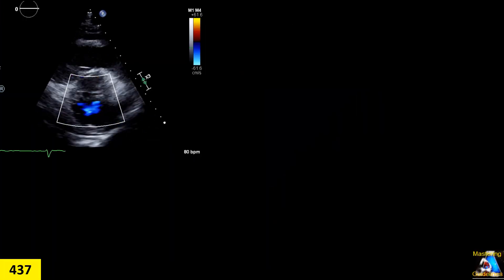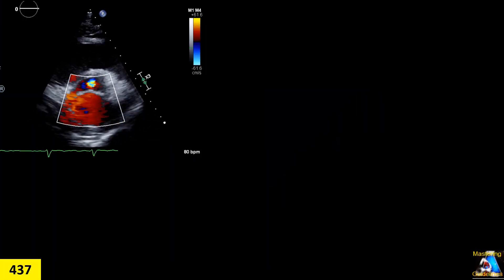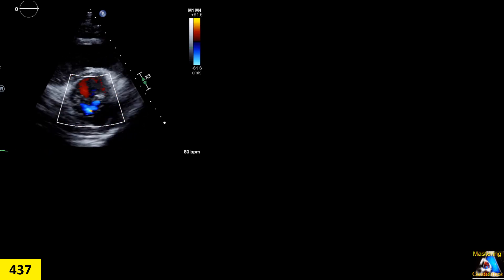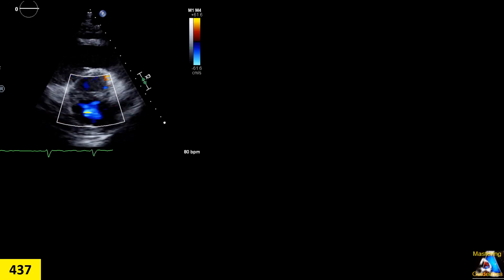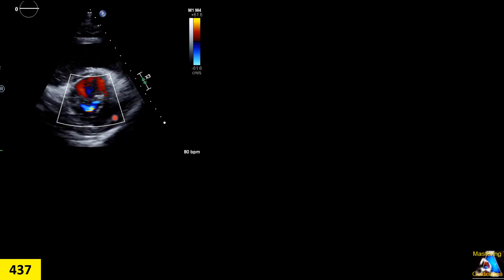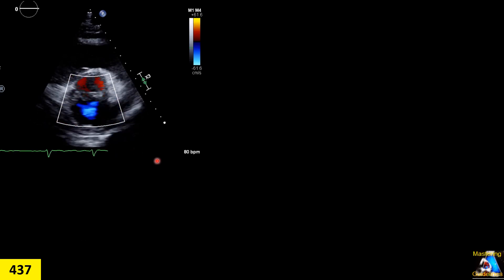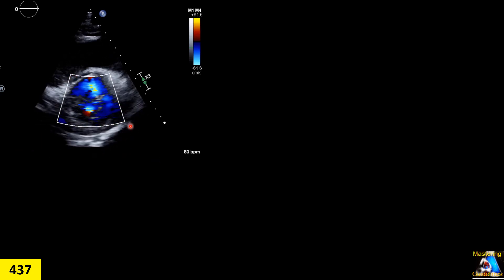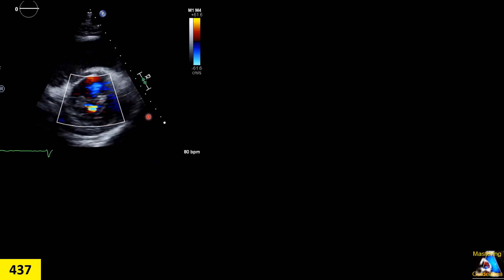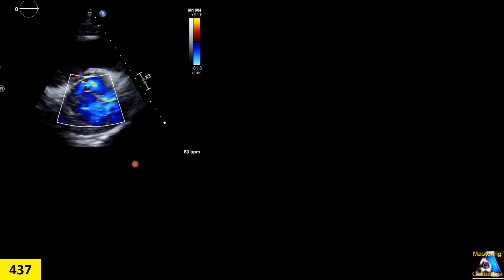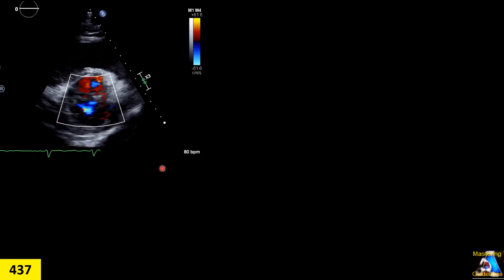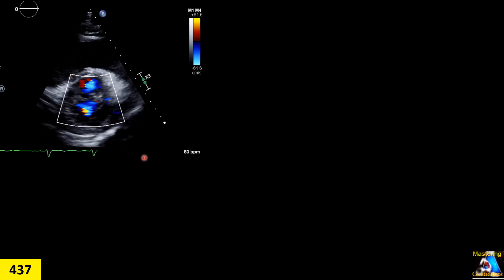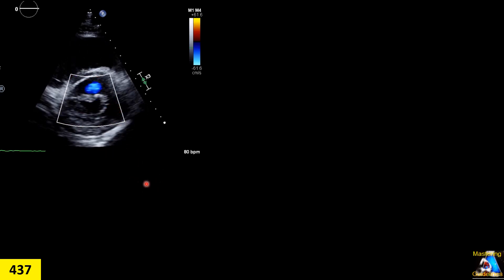One of the studies we do is color Doppler at the mitral valve level in short axis. On this case, we have this color Doppler image, and you have to tell if it is normal or abnormal. If it is abnormal, what are the findings on this case?